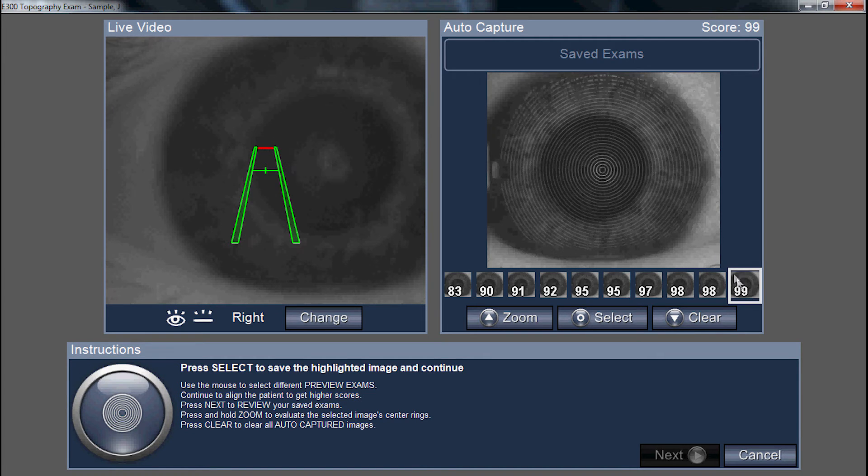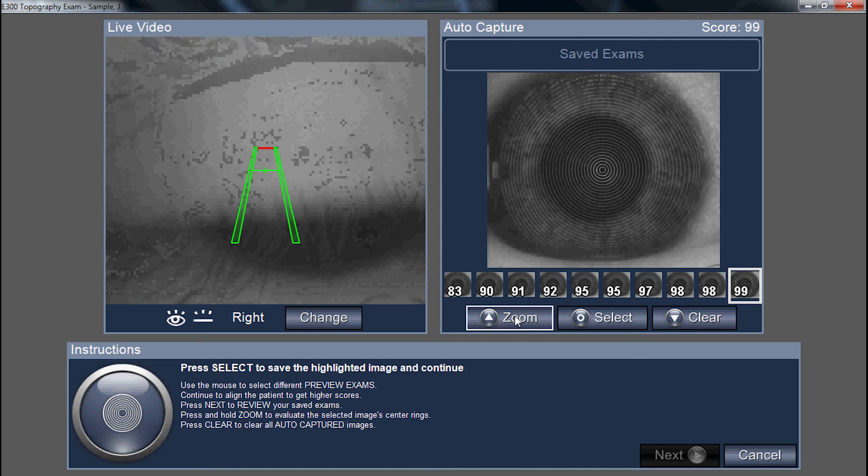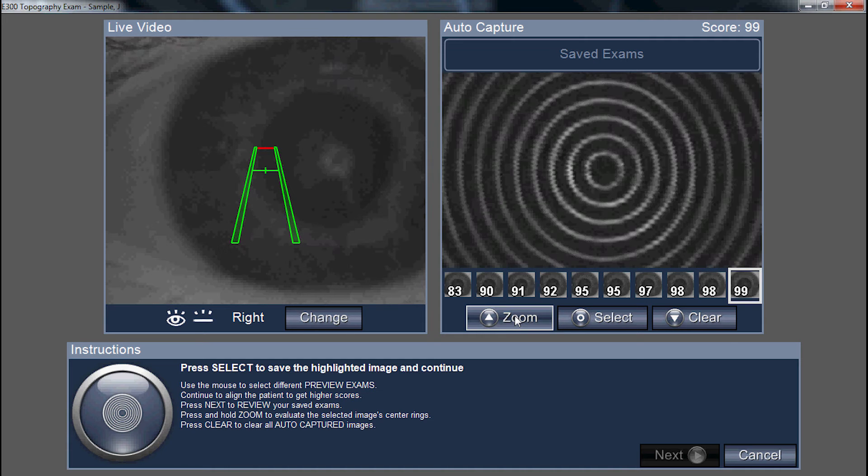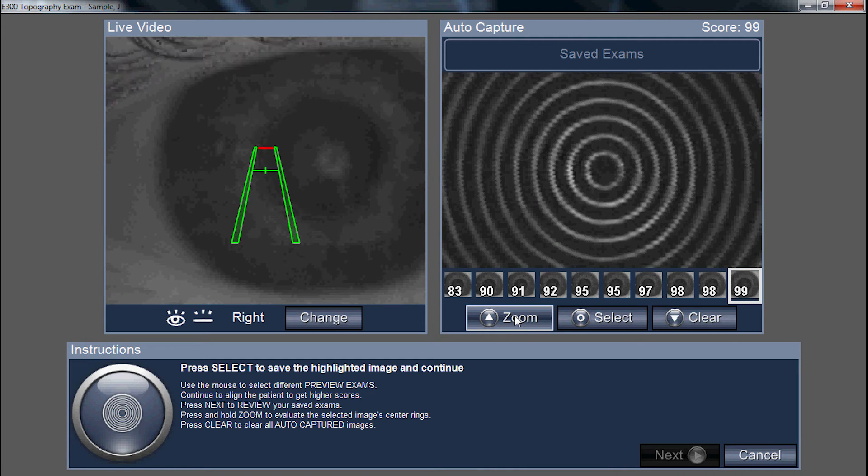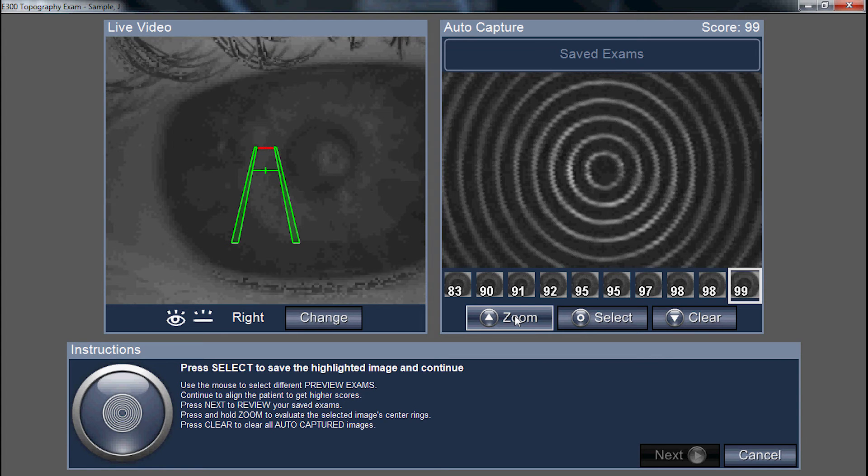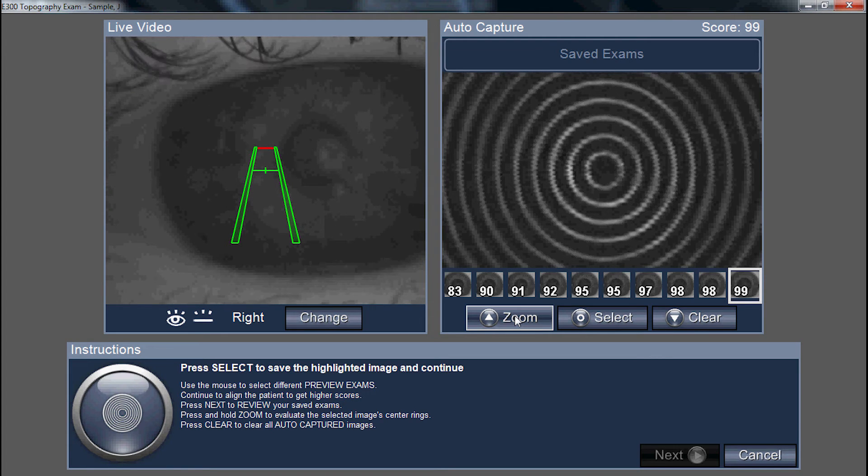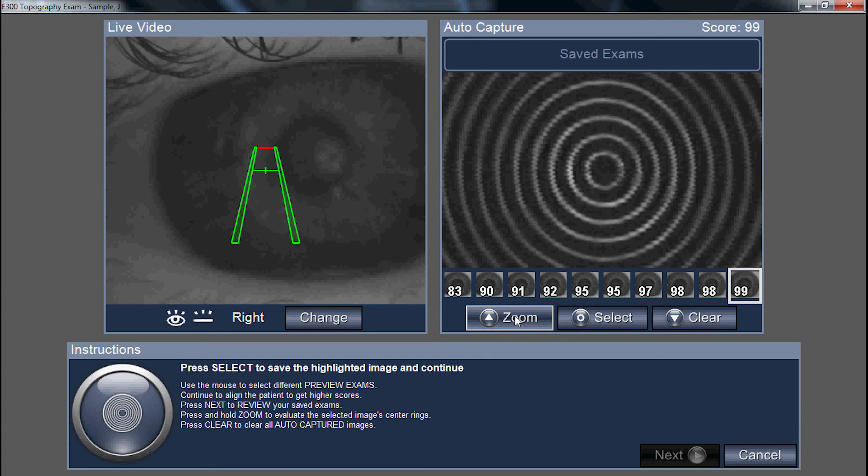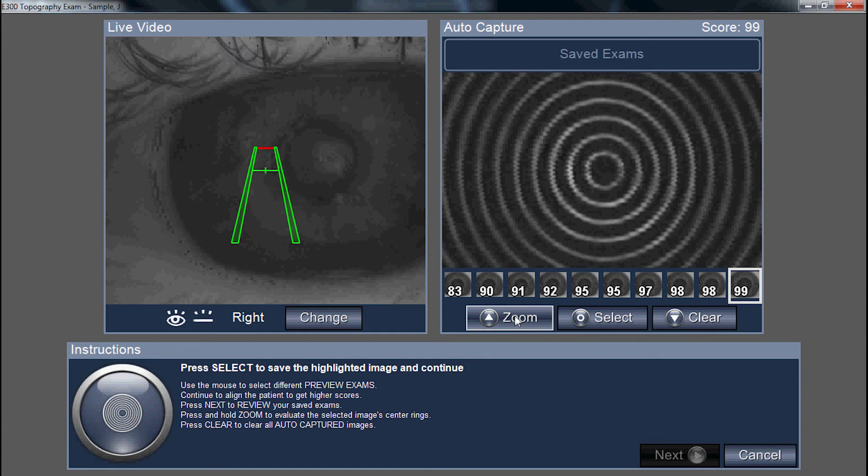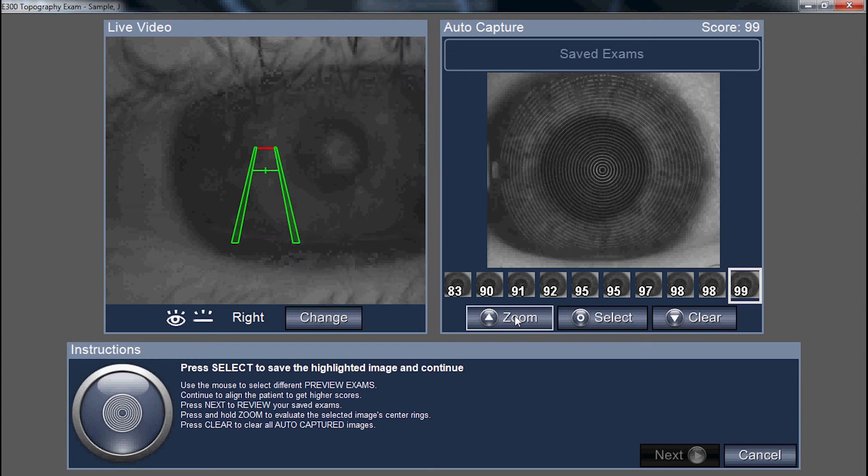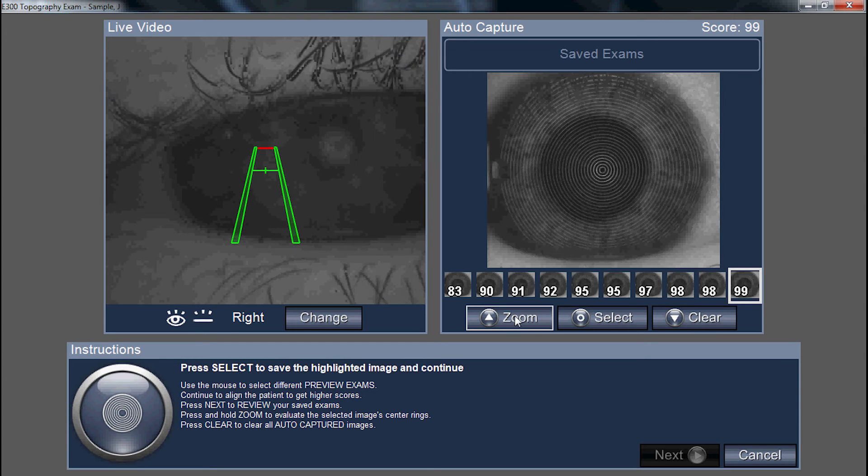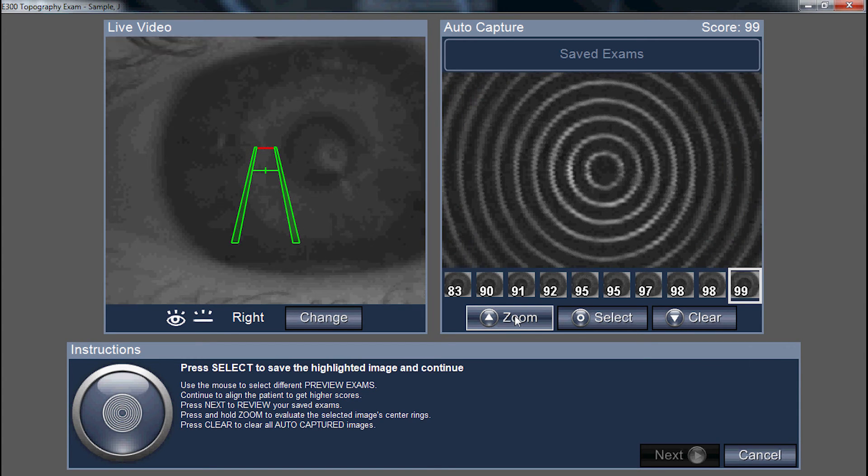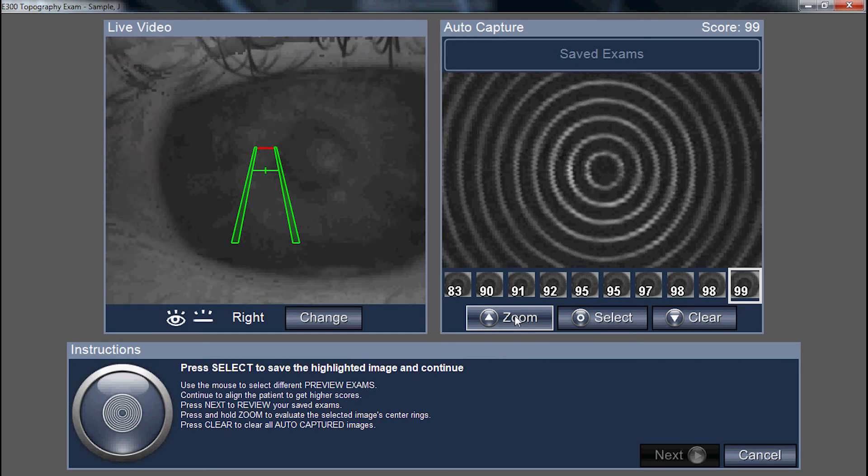To confirm that the Placido reflection is optimal, click on the zoom icon, hold it down, and assess the central 5 to 10 rings. They should all appear parallel and even, indicating an absence of tear film breakup. The topographer is going to construct eye shape from the center to the periphery, so it's important those central rings appear smooth, parallel, and even.